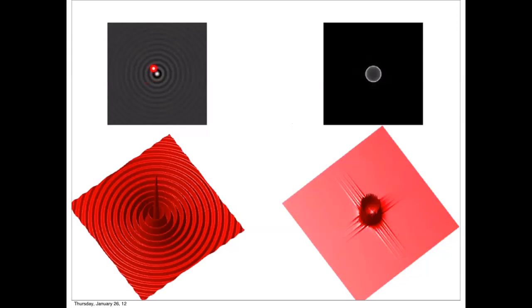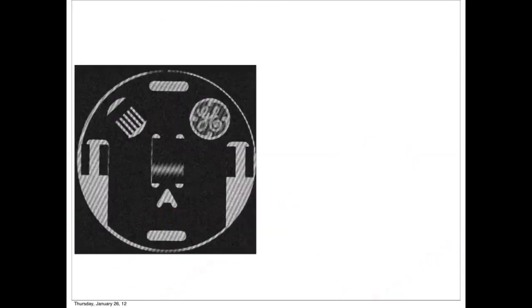Now this is a sinc of r. So if I take a sinc and make it radially symmetric, the result is going to look like a circular one, but the edges are emphasized. And that's why the jinc, it removes those edges, and then that becomes like a circular one. I don't know how to explain it, but if you do a sinc that is circularly symmetric, then it's going to have this really strong edge. Still a beautiful function. Okay, let me just show you some artifacts.